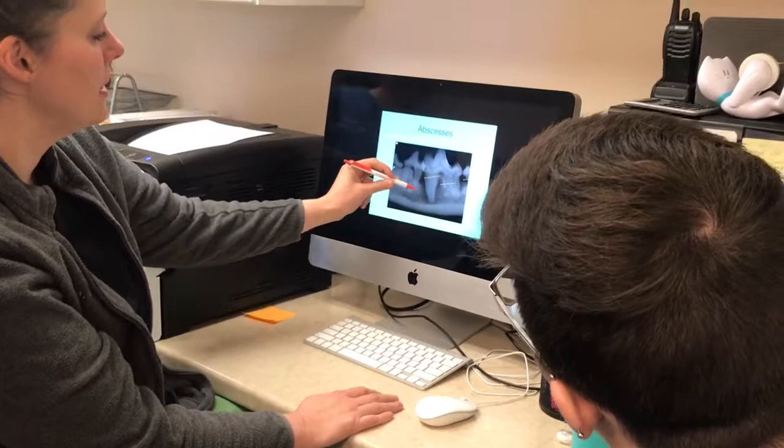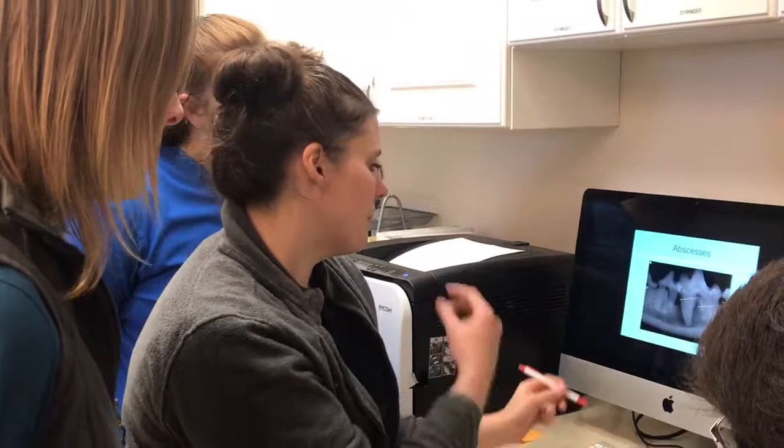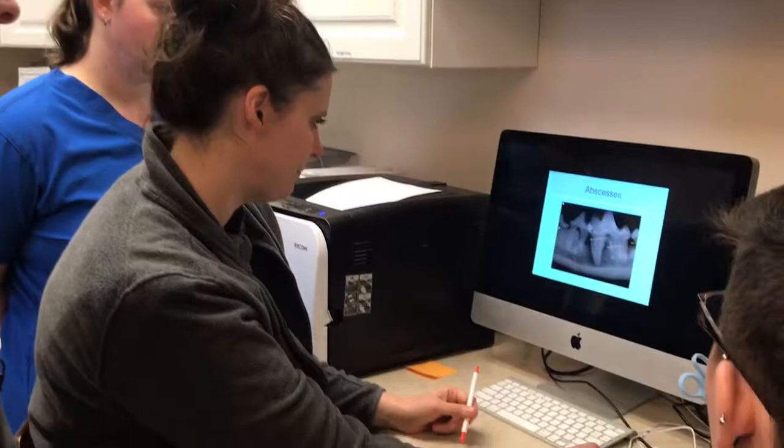This root has a big fat abscess around it. See this nice thin periodontal ligament line right here? That is totally gone here, and there's just this big black hole. Externally when we looked at this dog, there was pus coming out because this is a big pocket of pus.